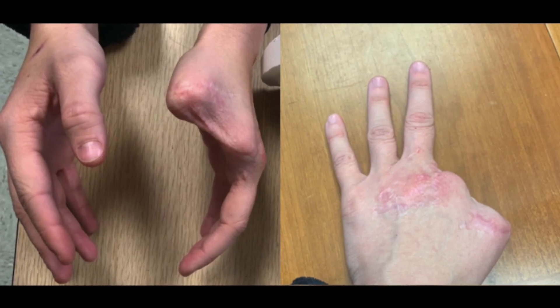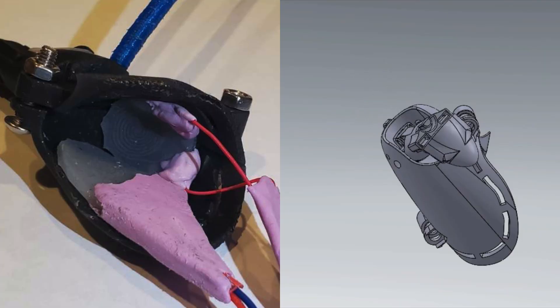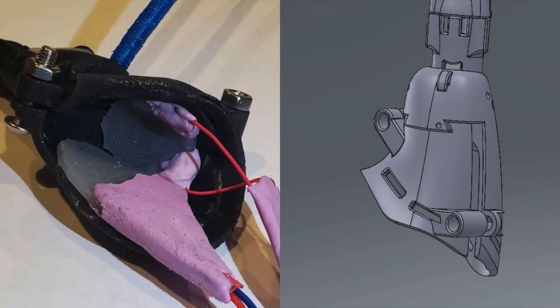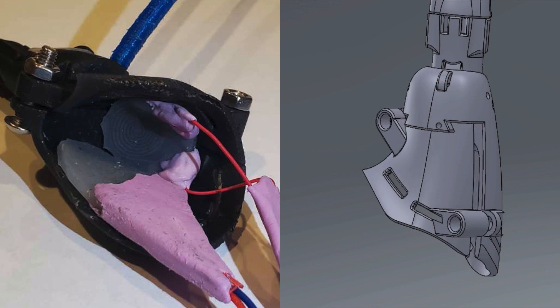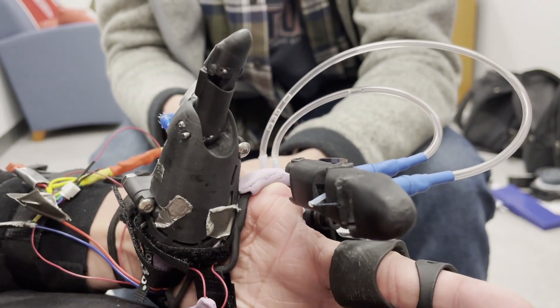Peyton's amputation occurred at the metacarpal phalangeal bone on both the index finger and the thumb. The thumb was left with a small amount of residual bone that provided her with a significant amount of movement. As a result, Peyton was able to control the thumb with two flexible liquid metal sensors attached to an adjustable thumb harness that clamps firmly onto her metacarpal. She can actuate the thumb by moving her residual bone side to side, deforming each of the sensors.